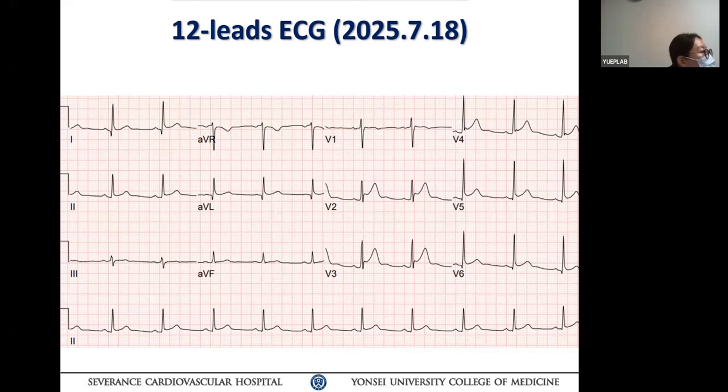No, I think it is a post-ablation procedure. Yes, post-ablation. So they did not do epicardial puncture. Did you do epicardial puncture in this patient? Did they do epicardial mapping? Or just an endocardial approach? No. Just an endocardial approach. So that would not give a pericarditis. There's not a chance. Would it be interesting to know whether this ST segment is resolved at subsequent follow-up ECG? Yeah, this is not a normal ECG we see.